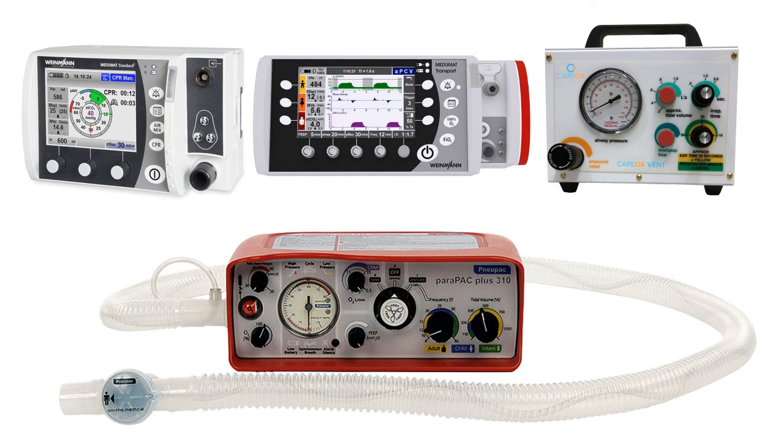There are ventilators that can be used outside of the intensive care units, and I'll introduce you to some of them very briefly. These are the transport ventilators.